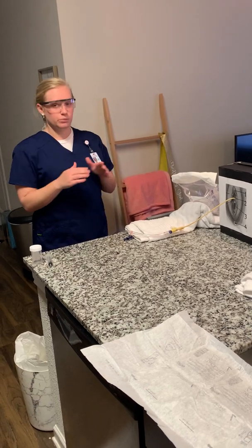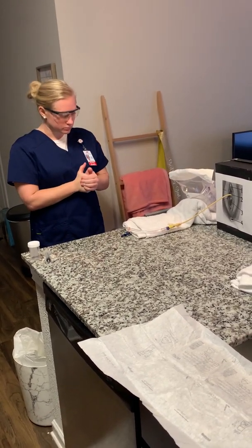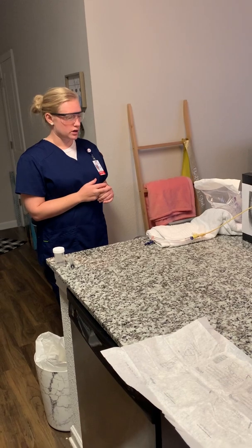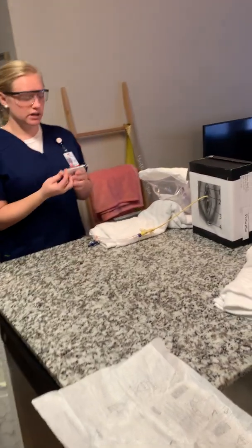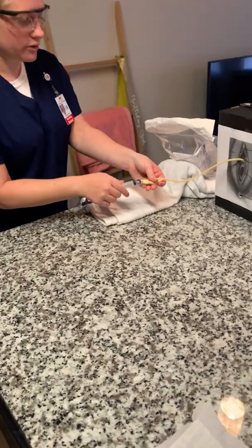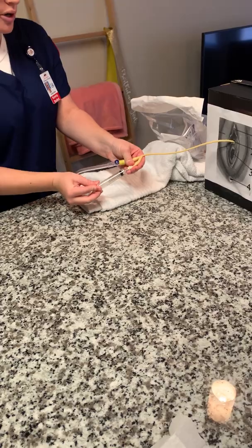So I would perform hand hygiene, put on my gloves and my goggles, which I already have on. And then I want to drain the urine bag, with a towel and a container, and I want to make sure to measure it. So to take the catheter out, I'm going to use a 10 milliliter syringe, and I want to make sure it works properly. I'm going to pull it back a little bit first, and then insert it in the port.